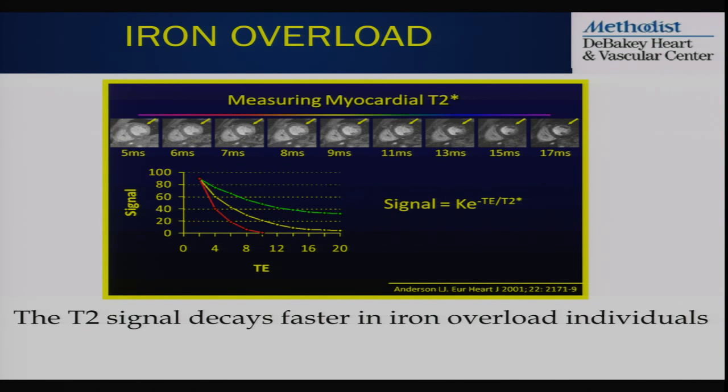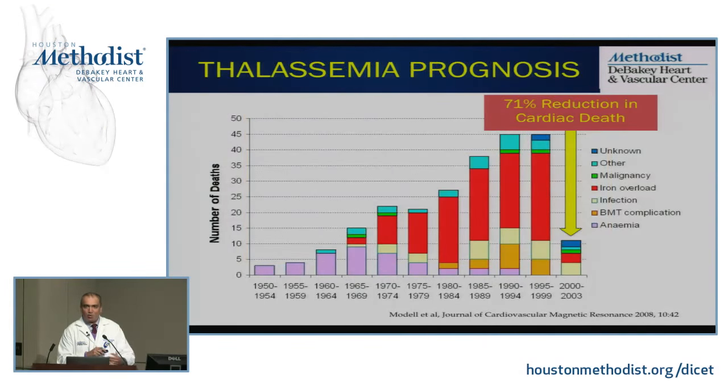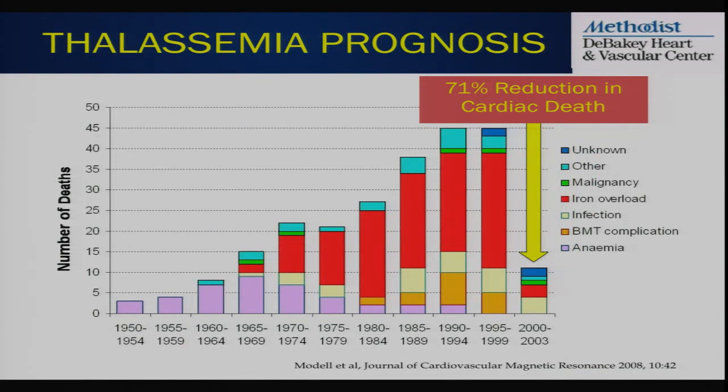So now we have all of these liver transplant evaluation patients that they're concerned about cardiac involvement. Literally, the patient can go in and out of the scanner within a minute or two. I don't want to bore you with the physics of how this works, but it allows you to identify what we call the T2 star decay within the myocardium, and that correlates very closely with iron content. This has been shown in numerous pathologic correlation studies.